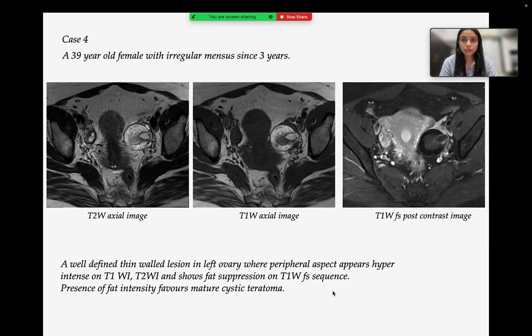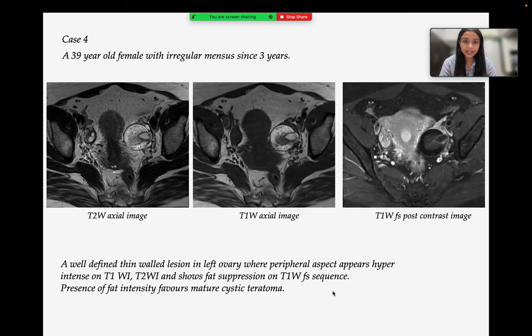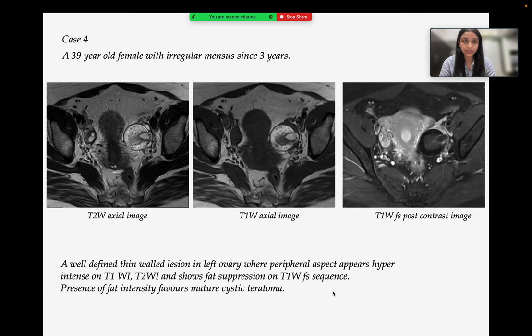Case 4 is a 39-year-old female with irregular menses since 3 years. Images show a well-defined thin-walled lesion in the left ovary where the peripheral aspect appears hyperintense on T1 and T2-weighted images and shows fat suppression on T1 fat saturation sequence. Presence of fat intensity favors mature cystic teratoma.